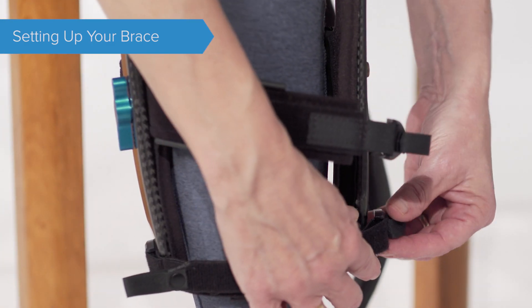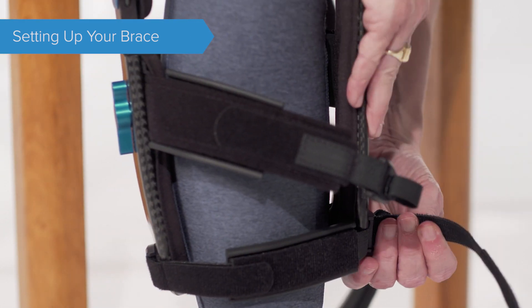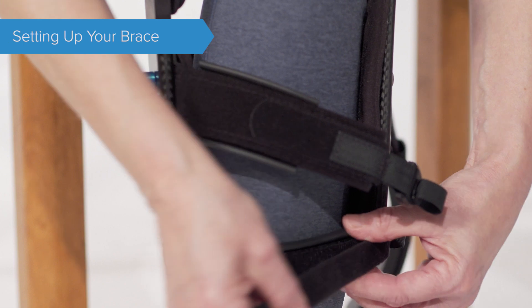Position the strap over your leg and fasten the quick release clip. Release the velcro and pull until comfortably snug, then fasten the velcro again.